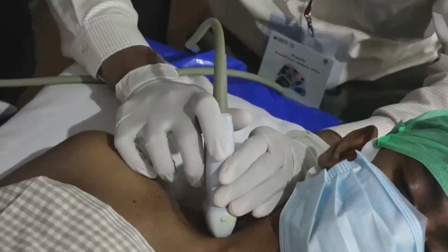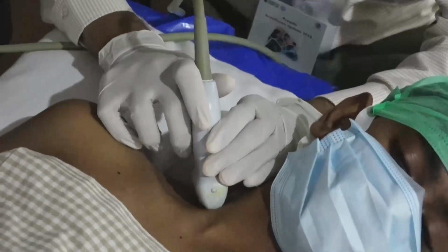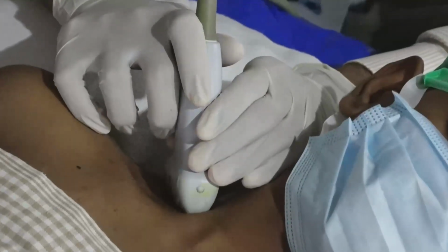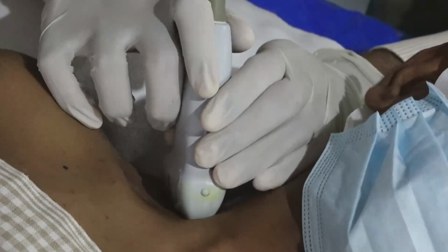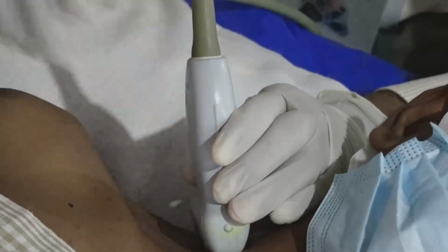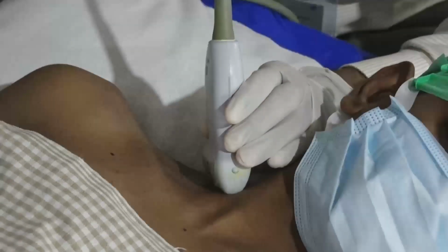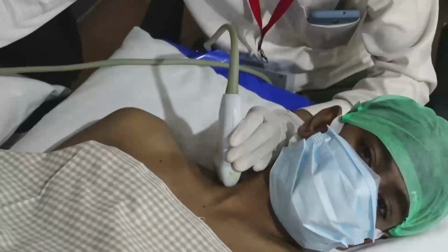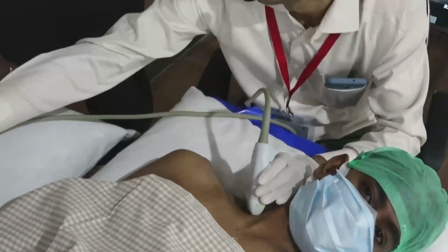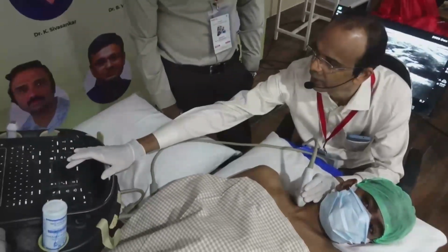And the next one we are seeing is, here we could see that, so this is C5, these two components are C6. If I come down, they are merging together. Now it has formed the upper trunk.